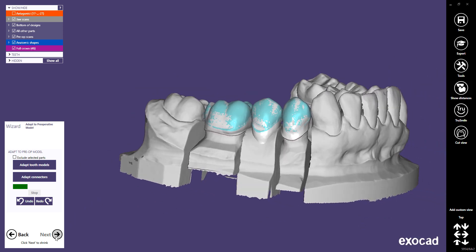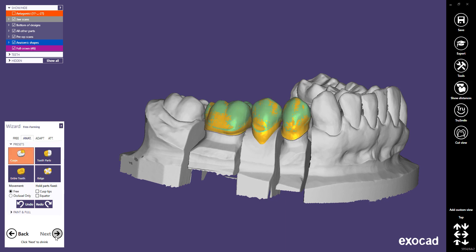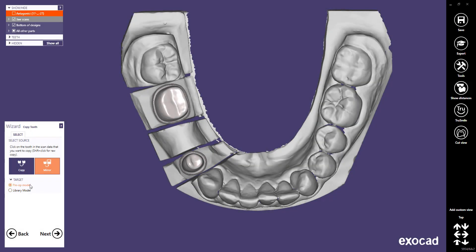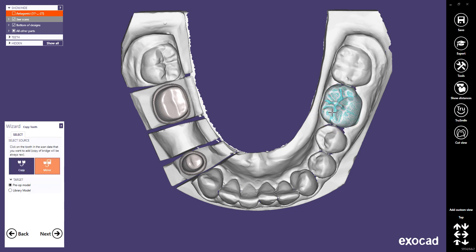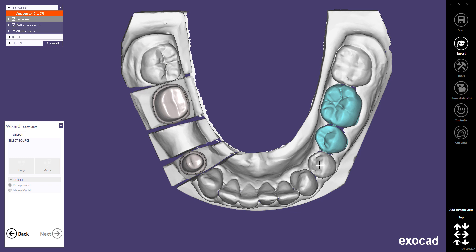We will start again with the Copy Tooth dialog to show additional functions when mirroring with a pre-op model target. You can copy several teeth at once to a single pre-op model — for example, to quickly copy a bridge. Once you have selected the first tooth, use Ctrl and left mouse click to add and select another tooth, allowing you to select a complete block of teeth for your virtual pre-op.